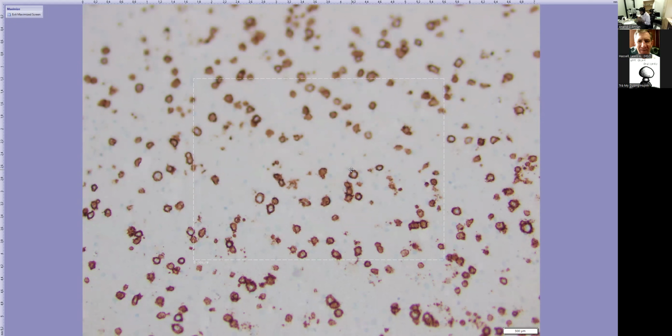So I did the whole large B cell lymphoma workup, and this was negative for CD10. It was positive for BCL6. MUM1 was positive in this case. So we were thinking of large B cell lymphoma, but the pattern was pretty odd. And flow cytometry was not done because lymphoma was not in the differential. So I did not have any way to confirm the clonality of these cells by flow cytometry.